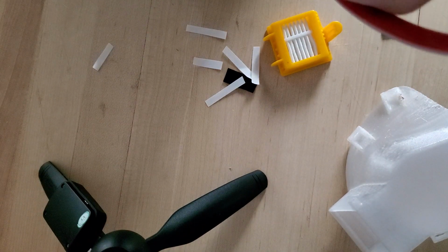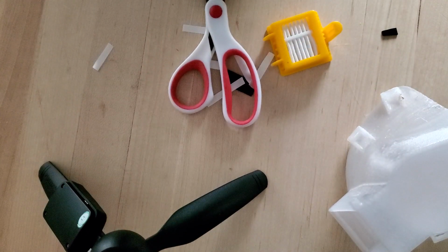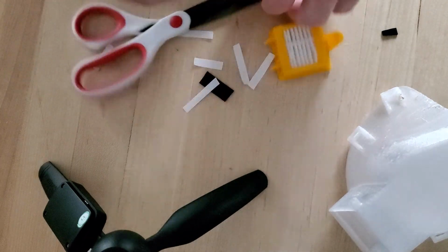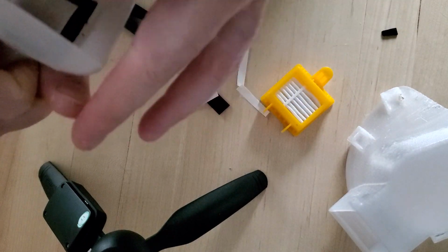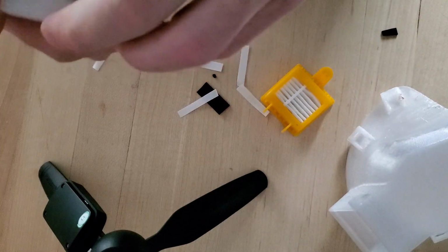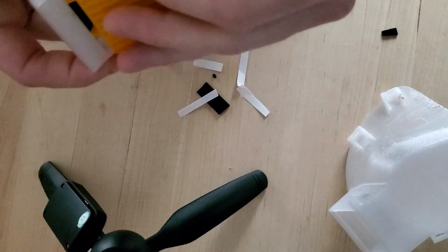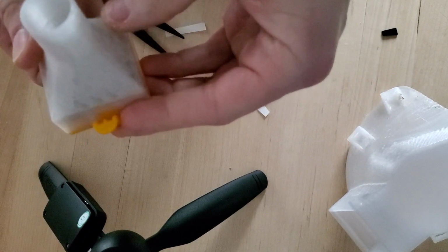Once it sticks, you're in trouble. There we go. I just cut off a tiny little piece. So now we've got our gasket formed, and as you compress it, it'll really squish together. So now it's sealed. Okay?